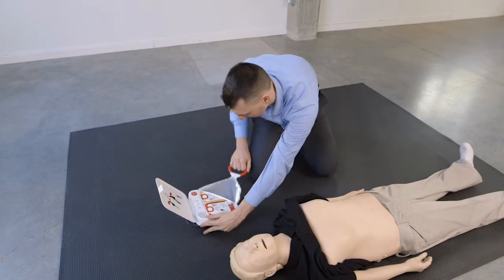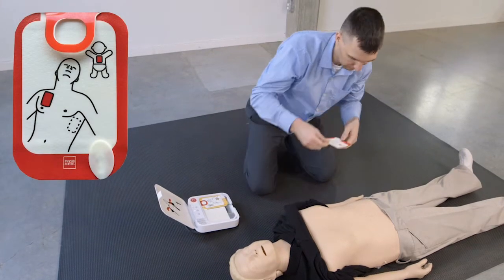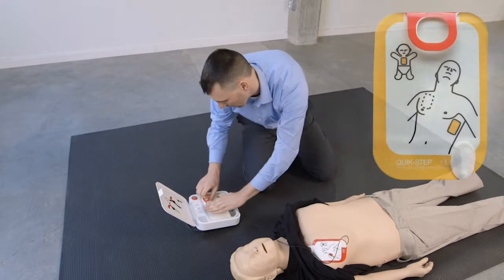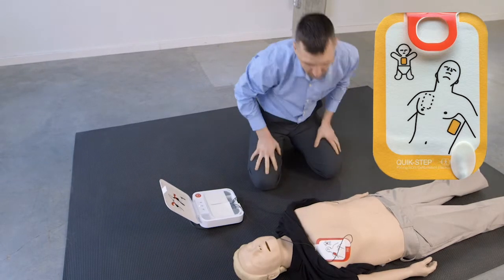Look at pictures on pads. Apply pads to bare skin exactly as shown in the pictures. Press pads firmly.